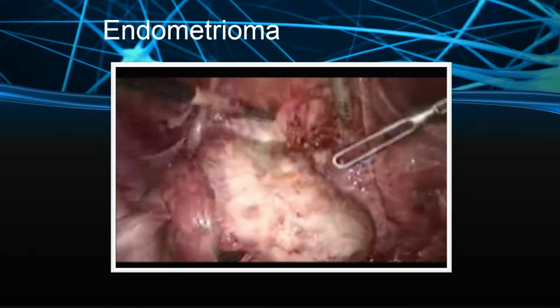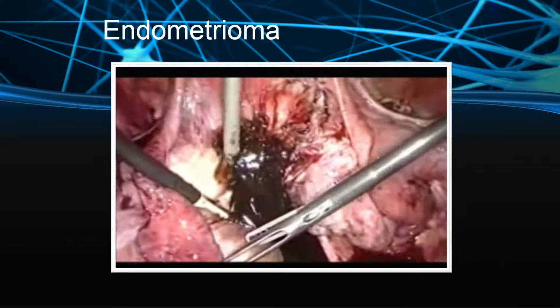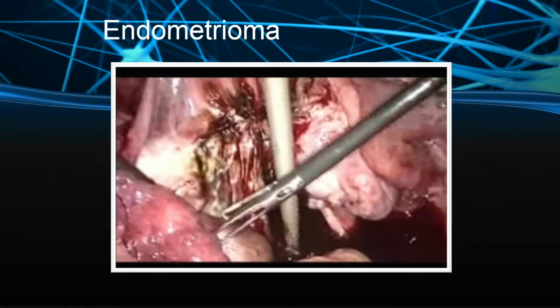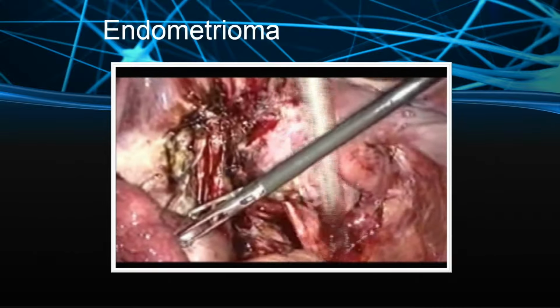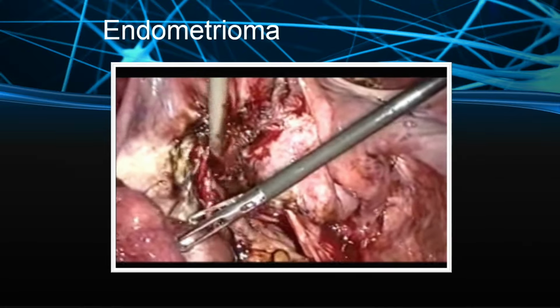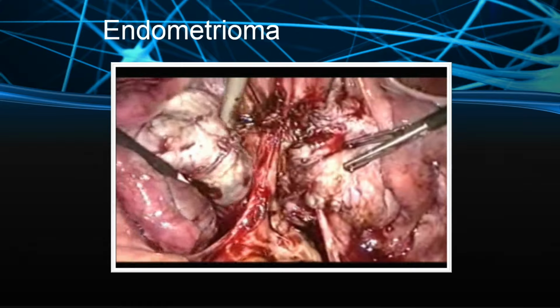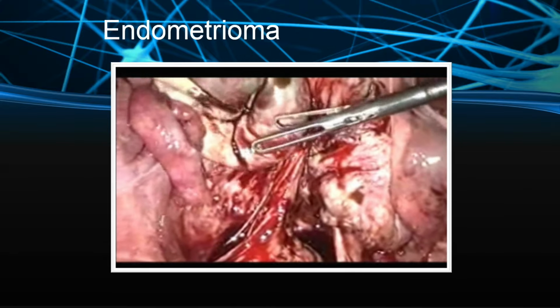So, most of the time in open surgery our strategy is to take the entire cystic wall out. Here the strategy is to use the energy to burn the margin, so that it will be destroyed in situ, rather than tearing the ovary out. This is from the rectum, it is adhered. Now, this is the left side, again ruptured.